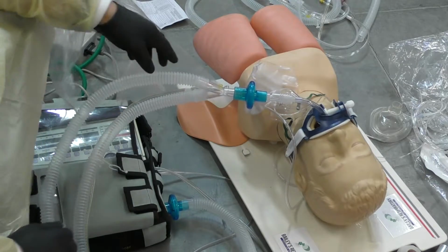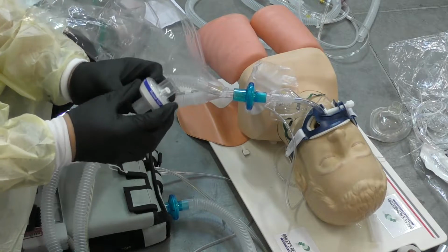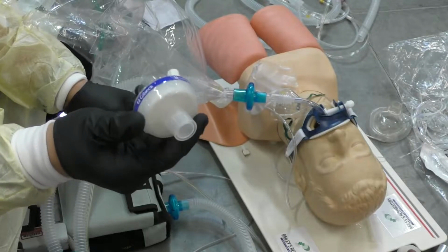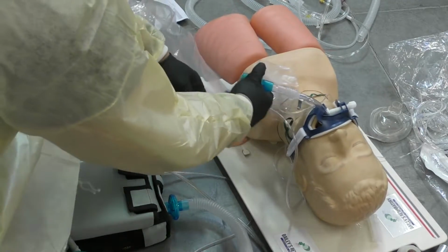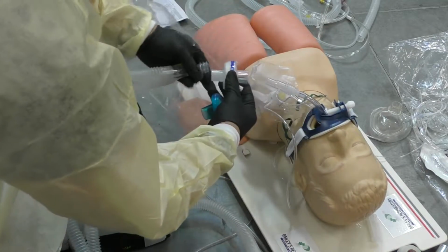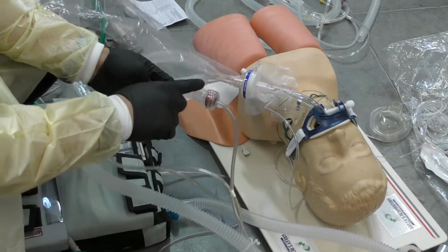If you happen to have an HME, which you'd probably be using for a ventilator, make sure it's one like this. This is an HME that also has bacterial filter capabilities. It's a combo. So if you get these, great, and that way you could use this. And you'll also create some humidity for your patient, and it'll block those filters. Again, this is where it's coming out.